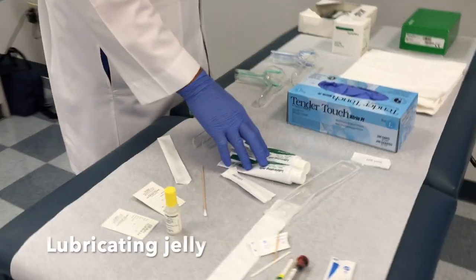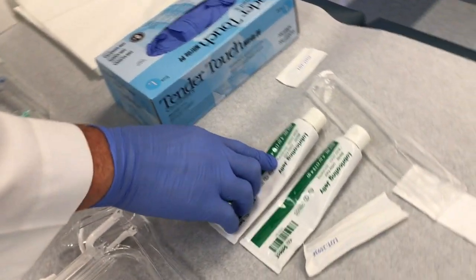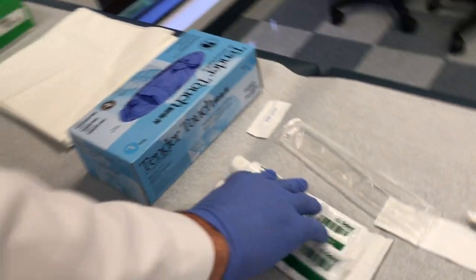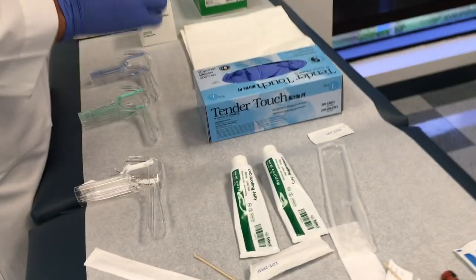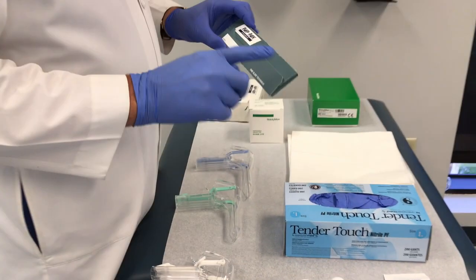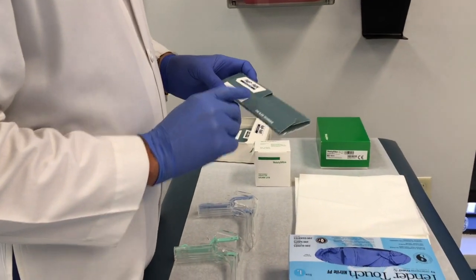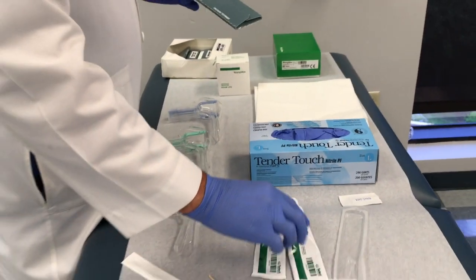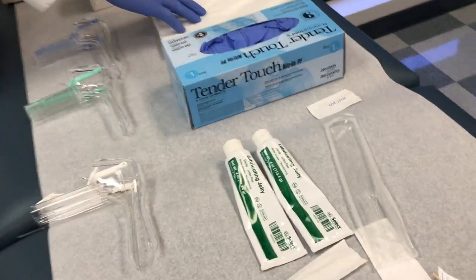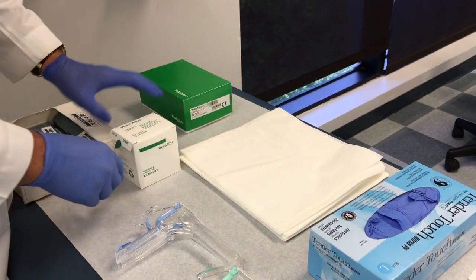We have our lubricating jelly — this is medical grade. The problem with KY jelly, unless it's specifically designed for a hospital setting, is that it can cause false negatives, false positives, or actually distort the findings on our cytology slides. We always want to make sure we're using a latex-free, hospital-grade lubricating jelly. We also have drapes for our patient, which are extremely important to protect modesty.